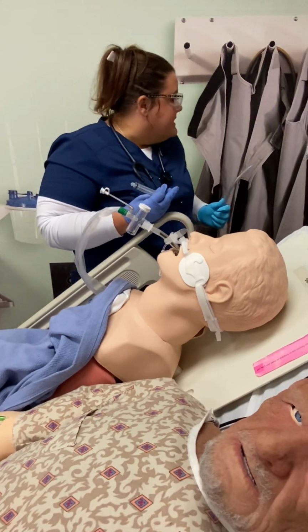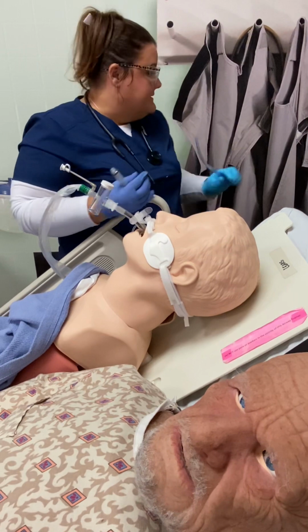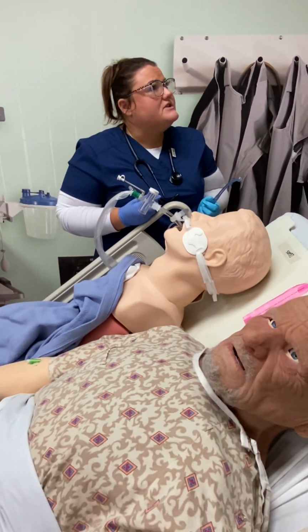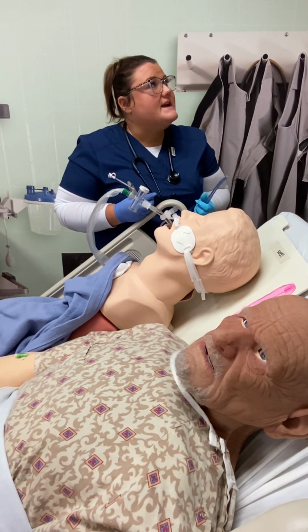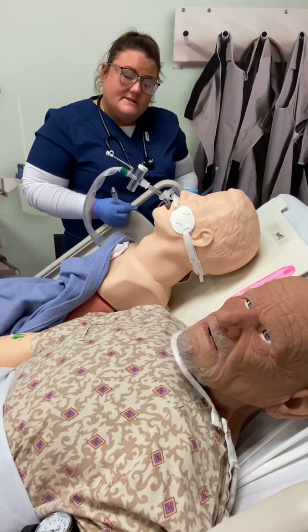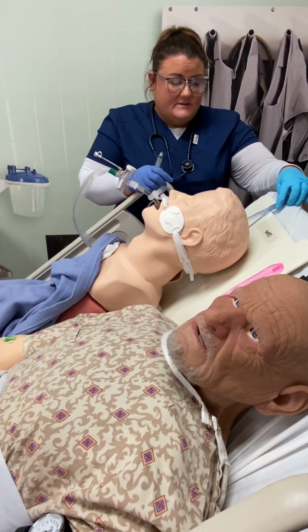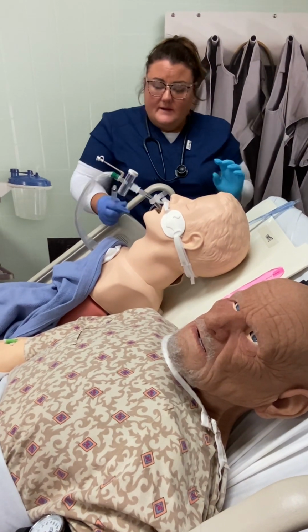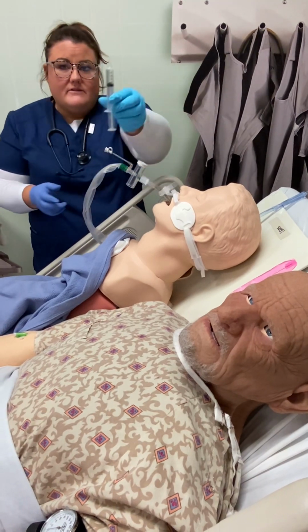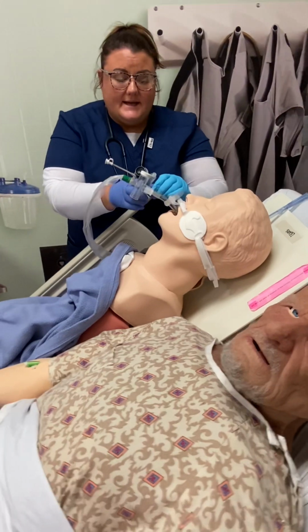All right, so it's all ready. His ventilator is looking good. So I'm checking his heart rate, his respiration rate, his SpO2, his blood pressure, and his EKG. Everything looks good. Okay, Mr. Smith, I'm just gonna get you suctioned out. So I would have this yonker and it would be in a sheath, and I would just place that at the head of his bed. Okay, so first thing, I'm going to draw back 5 mils of air. I'm gonna flush this cath tube out.